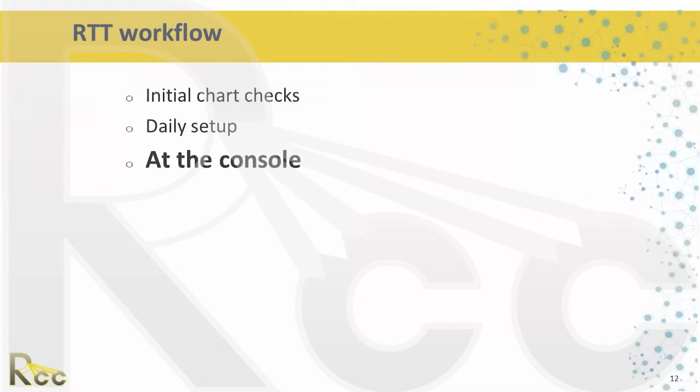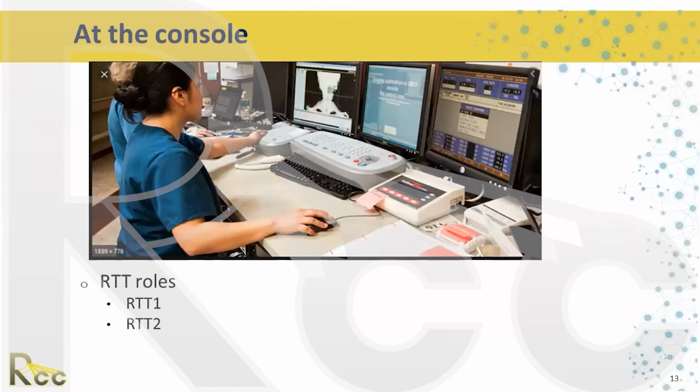It's really important to have 2 therapists at the console. The one therapist will be the driver, and the second therapist will be helping with the timeout. So it's definitely a team playing role. Both people need to be paying attention and helping each other out, especially the second person. A lot of times it's easier to see things clearly when you're the second person over, so you're not under the pressure in the hot seat.